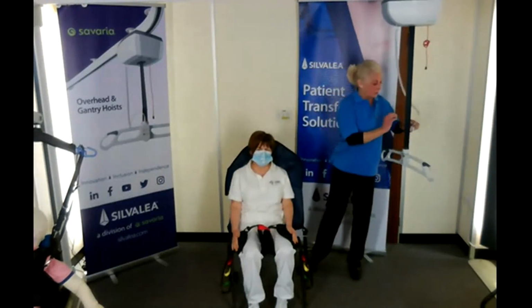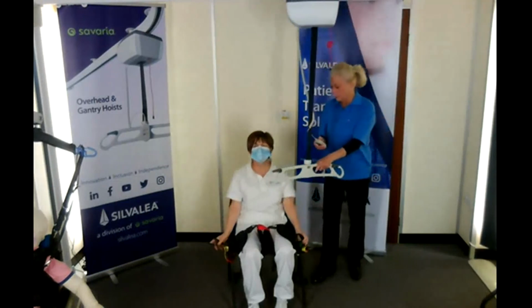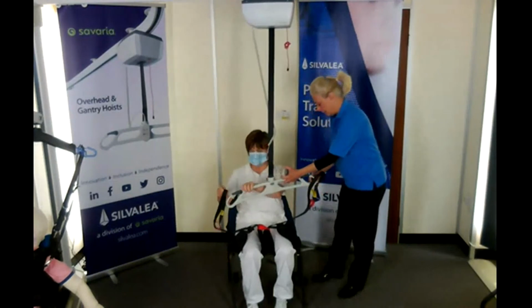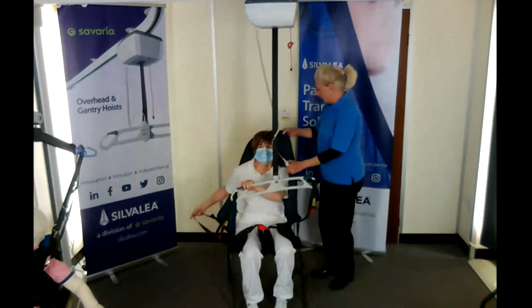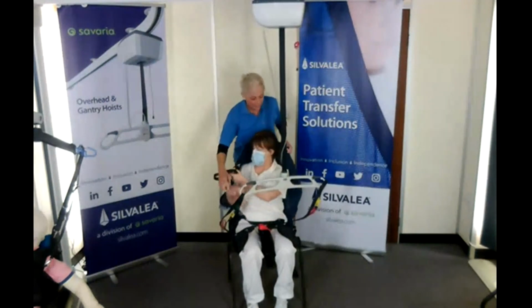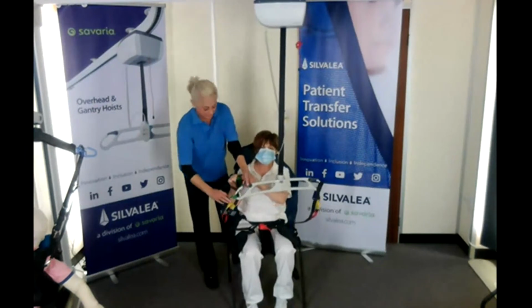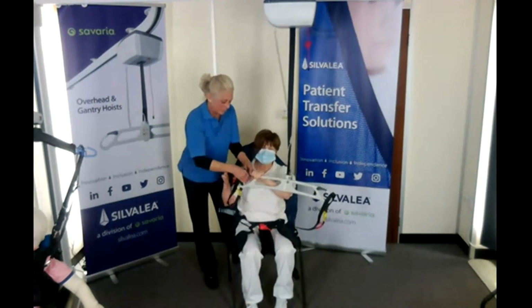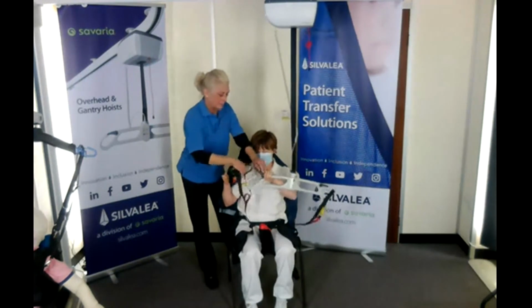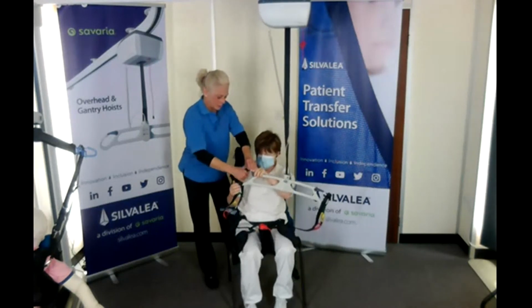So I'll just hook this up. Go on the green. So I'll just help Judith here. Green leg. Sorry, just middle there. Green shoulder there.